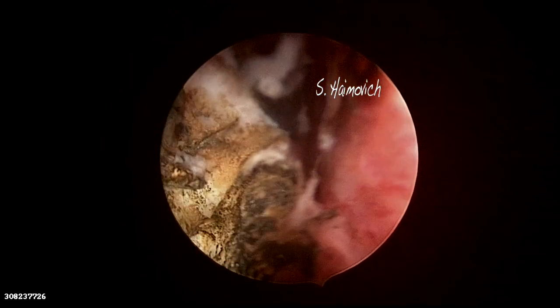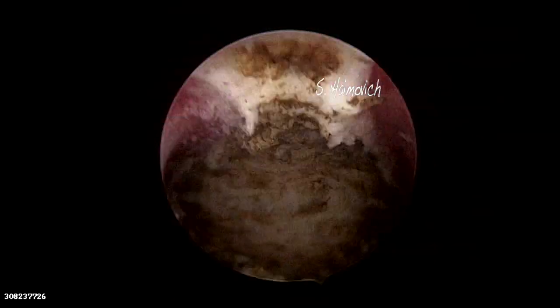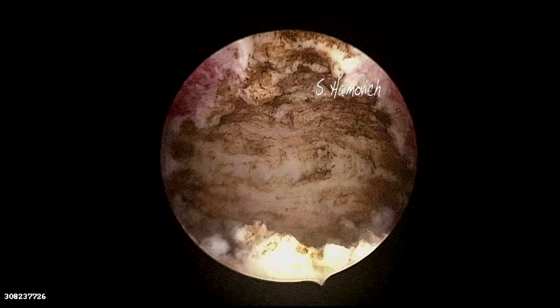After the local anesthesia was used, we were able to finish cutting the septum with the diode laser. Notice the size of the cavity and the two ostia aligned. Then we filled the cavity with hyaluronic acid gel in order to avoid adhesions.